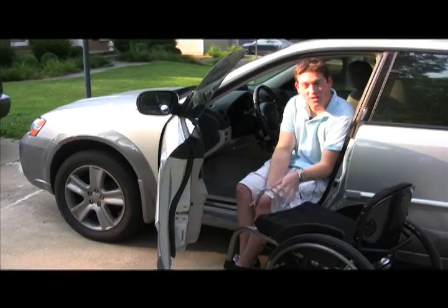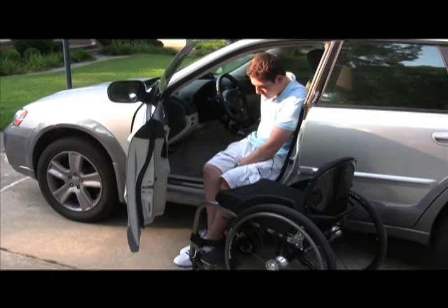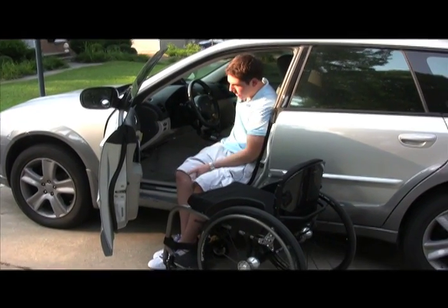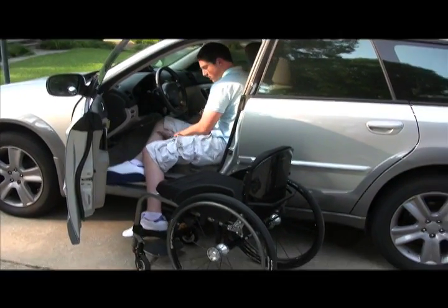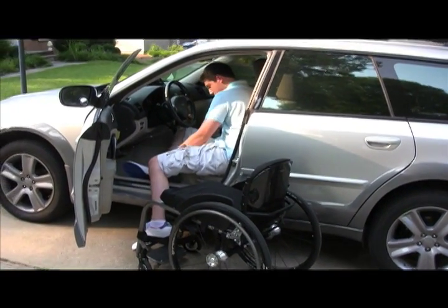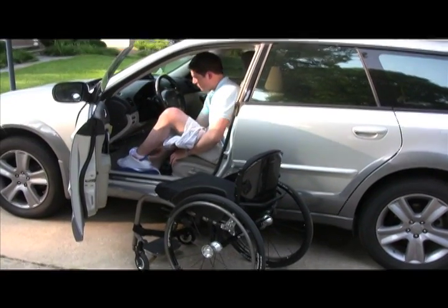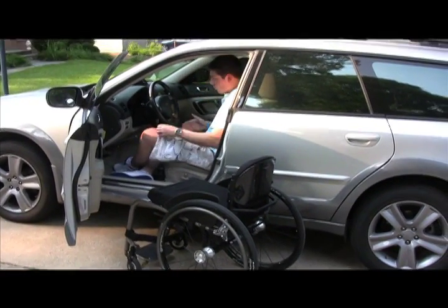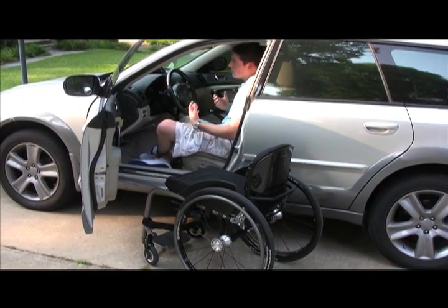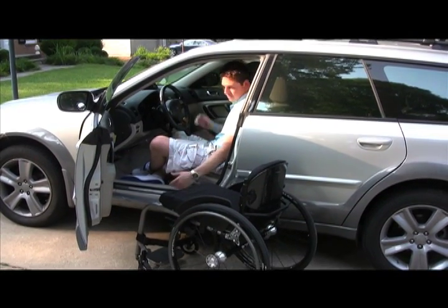Everybody's got a different style of transferring. That's just the way that works the easiest for me. And basically at this point, I just kind of bring my legs in at like a downward angle. I kind of slide them in underneath the steering wheel like that. I do one leg at a time, and then I'm just pinning up the left leg like that. Once I get inside of my car, I like to cross my legs because it's more efficient for space, and also if you have spasticity like I do, it makes them less likely to spasm while you're driving.